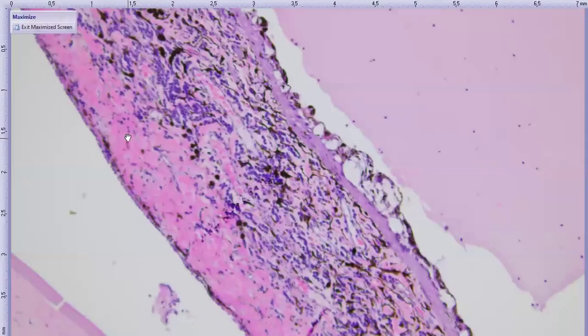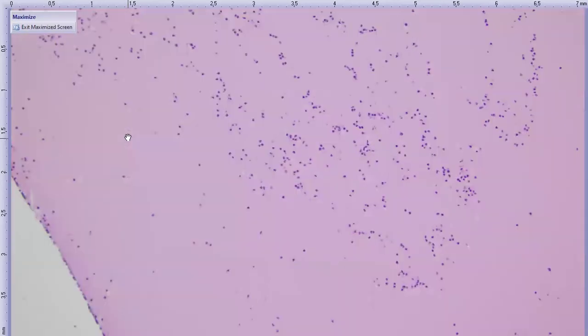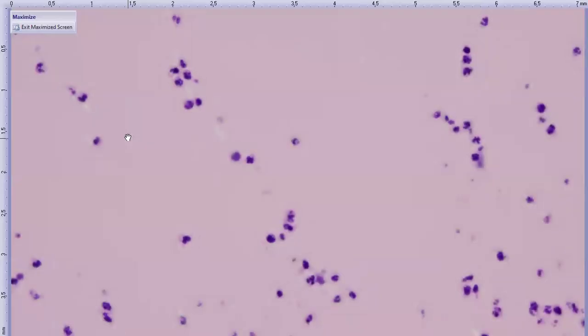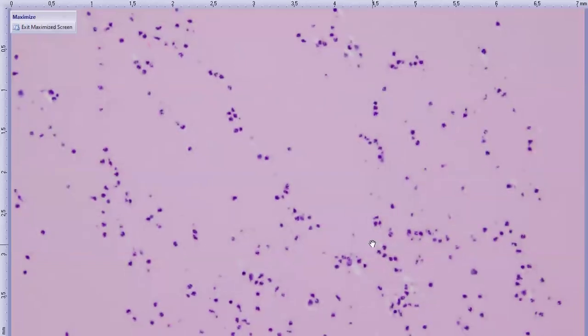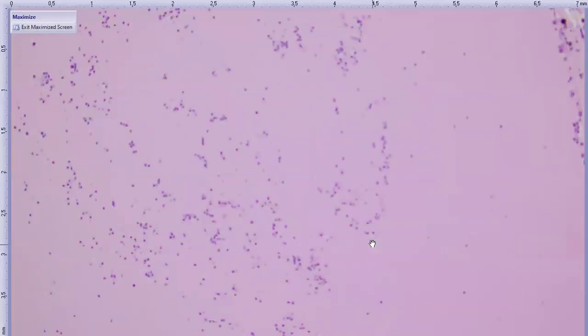Let's move over to the anterior chamber. So here's that proteinaceous material, and there are some cells floating around in it, which the clinician noted clinically. So these are mostly neutrophils in this area, maybe a few macrophages here and there as well. So we've got a little bit of an endophthalmitis. That is when you have inflammatory cells in the ocular chambers.